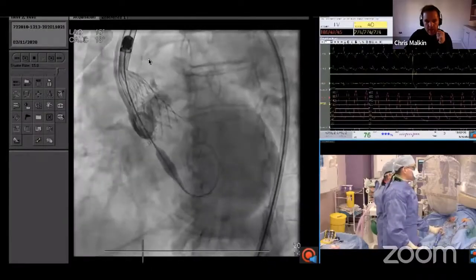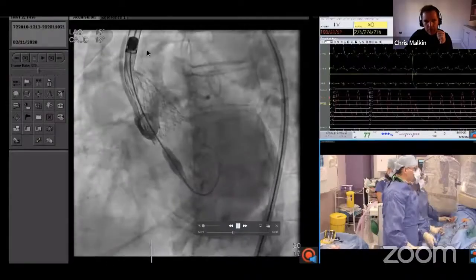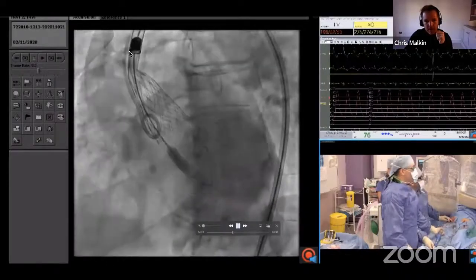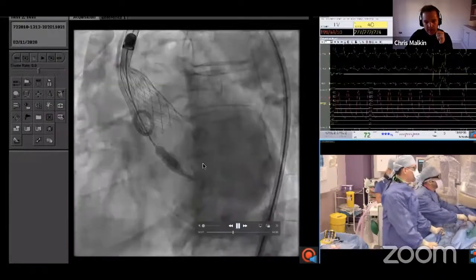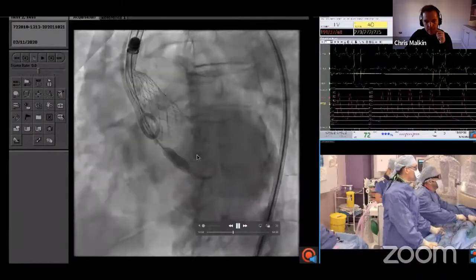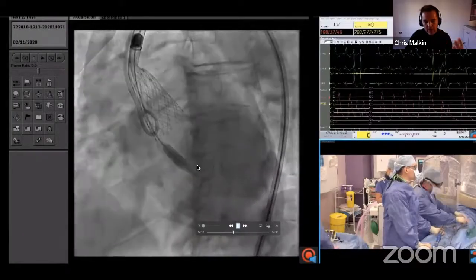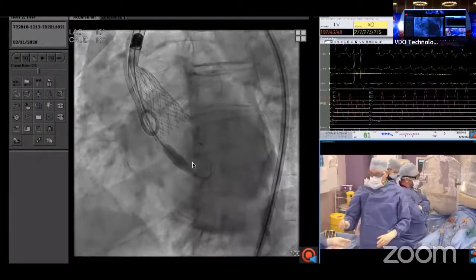And I'm gonna keep pressure in my left hand to make sure that this delivery catheter is pushed towards the greater curve. And you'll see that I will pull the wire out significantly so that the wire is floating. So there's no retrograde or aortic force on the system that could potentially allow the valve to slip up.